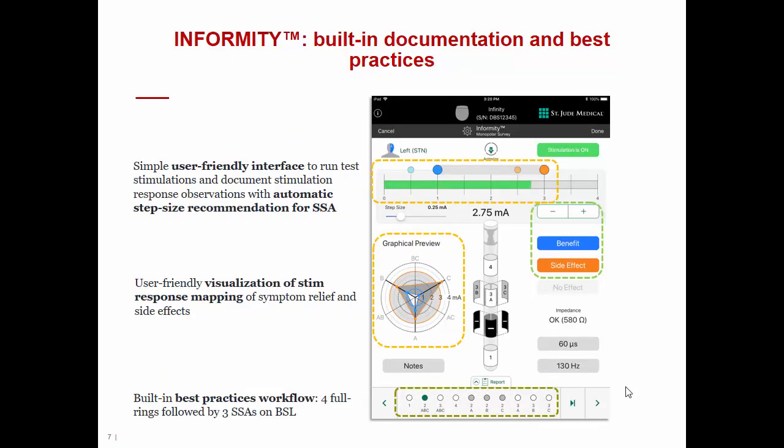Moving to the Informity platform, when using the clinician programmer and clicking on Informity, a screen appears. Starting from the top left, we see the indication of which side of the body we are treating — in this case, left STN — and on the right an indicator that stimulation is on. There is an important line showing 0, 1, 2, 3, and 4, indicating the stimulation intensity being tested. The green bar progressively increases as we push the plus button, at a step size that can be personalized — in this case 0.25 mA.